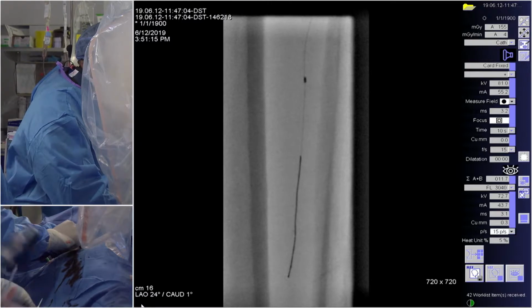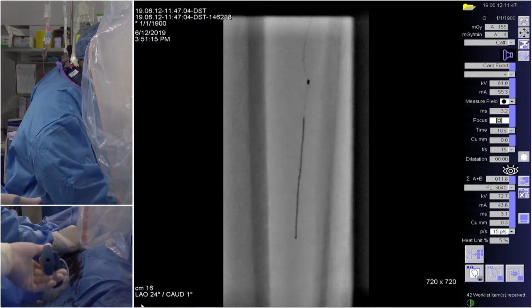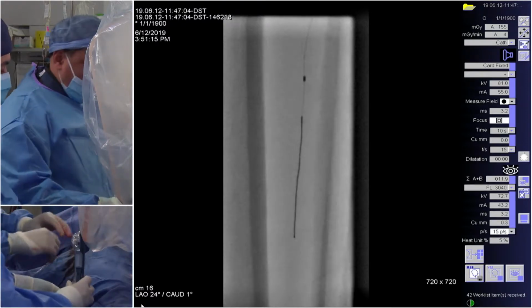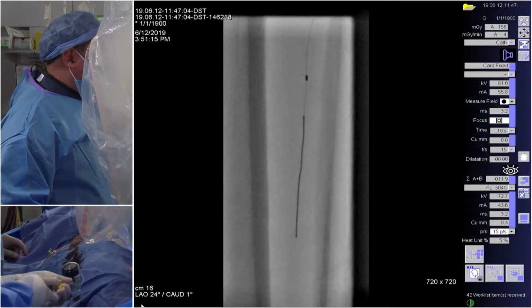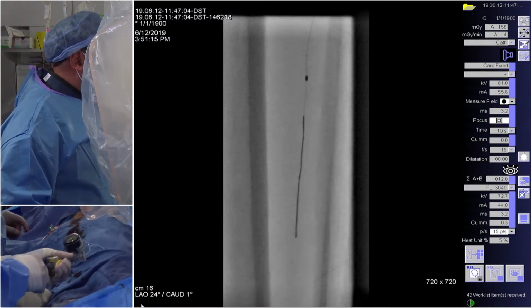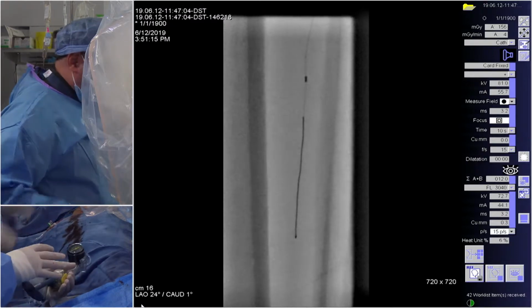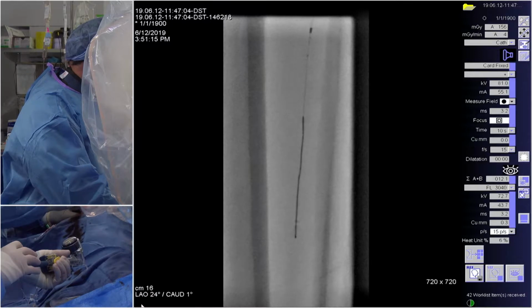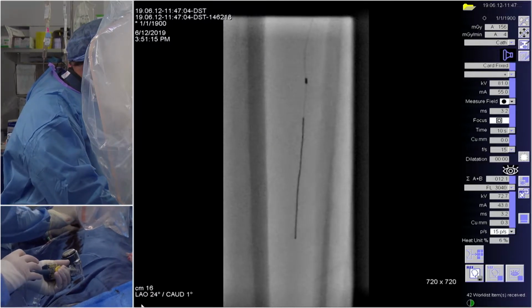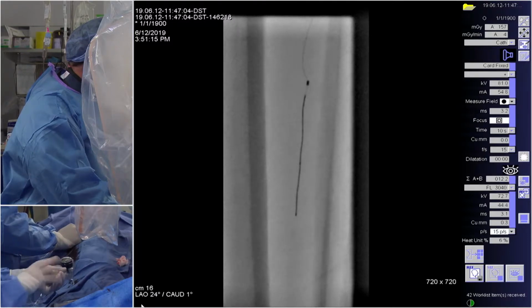Yeah, I got to tell you, that's kind of the reason why. You can see here, this is going to be a real pain. I think the reason, for me at least, the way the wire behaved, I knew we weren't free-flowing in the tissue, like we hadn't perfed all the way out. We might have been in a dissection plane adjacent to the vessel, but to me, that's not my worry. My worry was here, let's try to get as close to the reconstitution cap as possible. Go up here, guys, and then go ahead and do it.